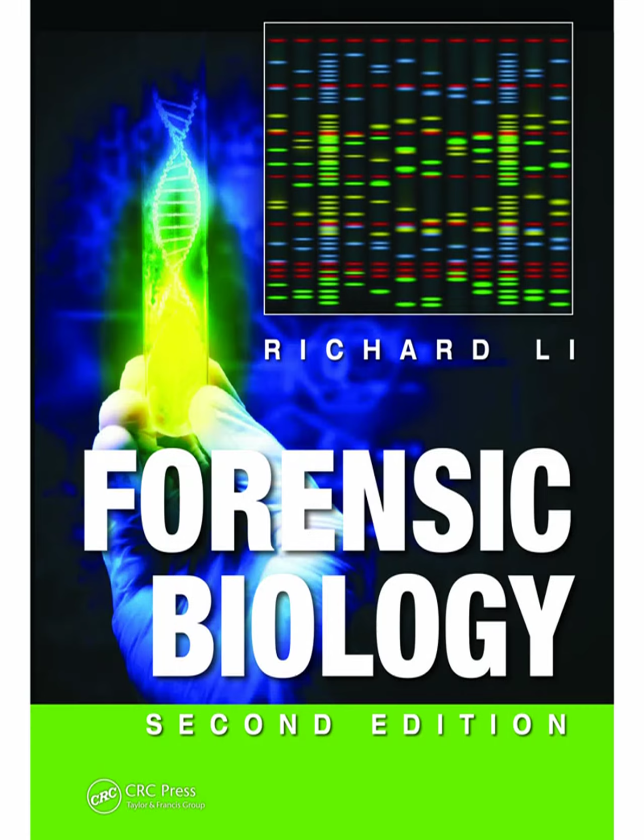So to sort of wrap this up, we started with that core idea. Forensic serology establishes the what, the class characteristic, before we get to the who, the individual characteristic via DNA. And we've traced the evolution from older methods relying on visible precipitation or agglutination, which needed quite a bit of sample, through to highly sensitive immunoassays like ELISA and rapid strip tests, though we have to watch out for things like the hook effect. Then into the molecular age, using DNA methylation patterns or specific RNA molecules like the stable mRNAs as highly specific tissue barcodes.